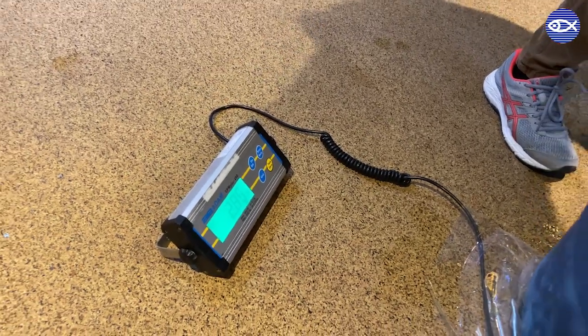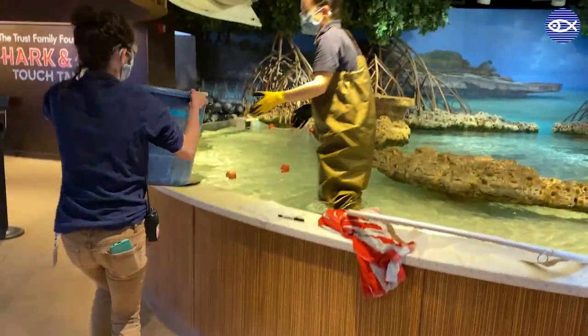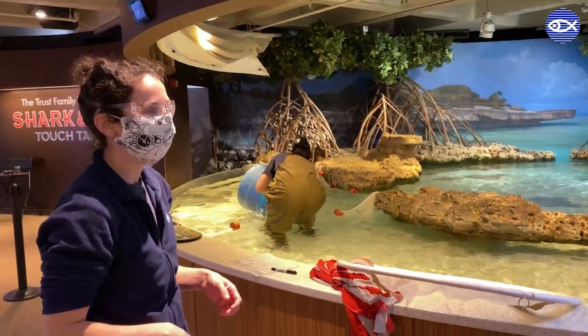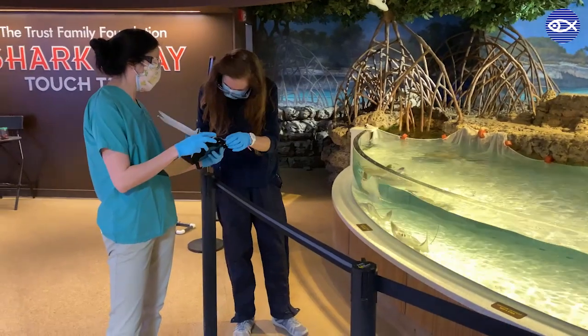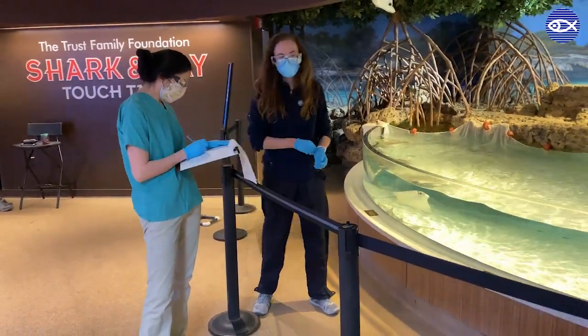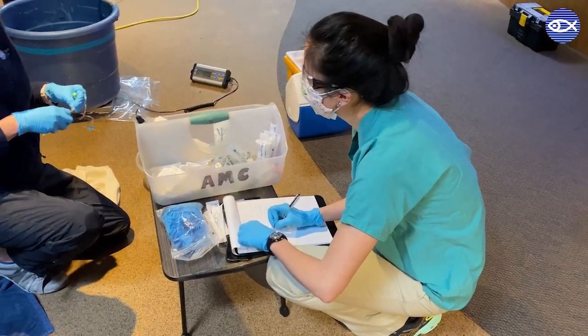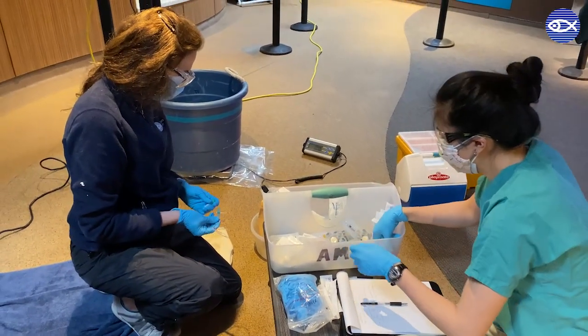After the blood draw, the ray is weighed prior to returning to the tank. Similar to humans, checking the animal's weights on a routine basis is a very important health monitoring tool, as unexpected weight changes can indicate the need for follow-up.